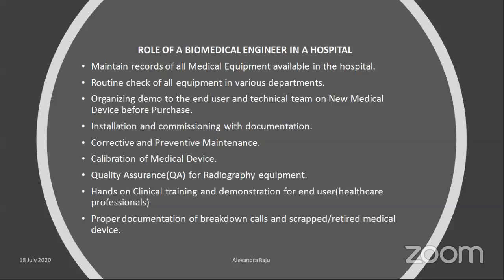So calibration of medical devices, or the QA for the radiological equipment. And the hands-on or clinical training has to be given to the end user or the medical professional. And more than that, we have to maintain proper records of medical devices. And if there is any breakdown or any repair that has happened to the equipment, the full history has to be maintained in the clinical engineering department. So I hope that's all about troubleshooting and maintenance of medical devices.